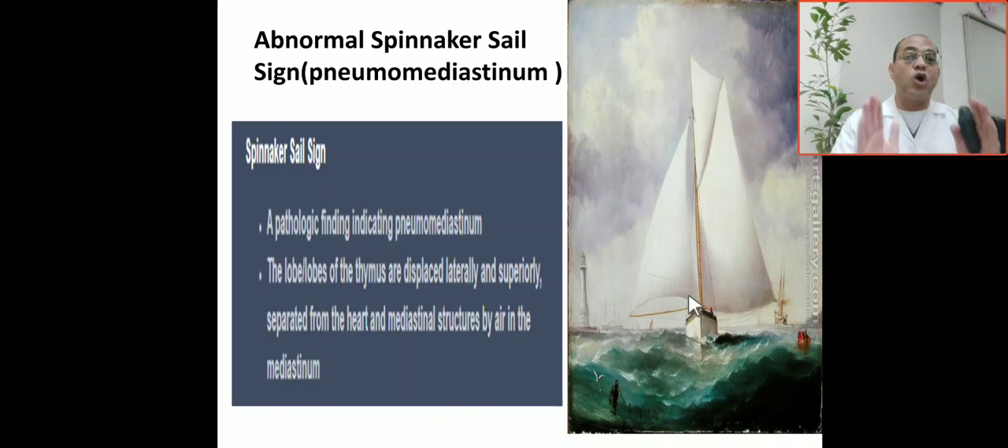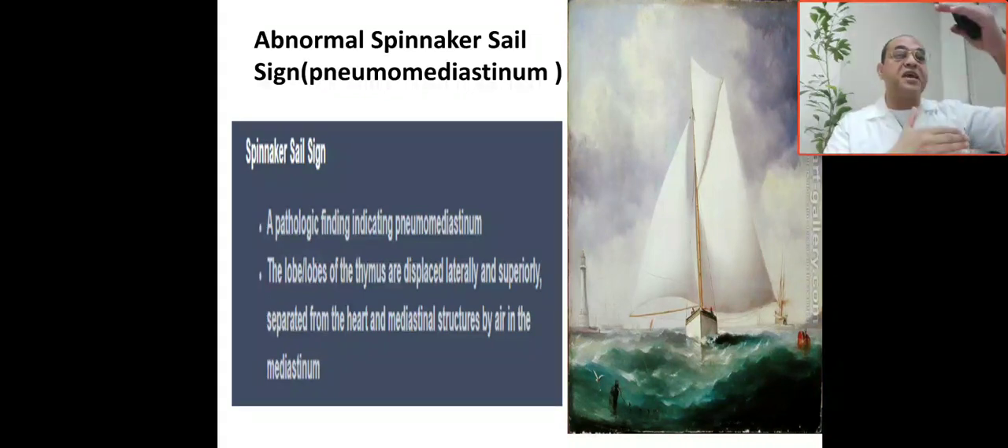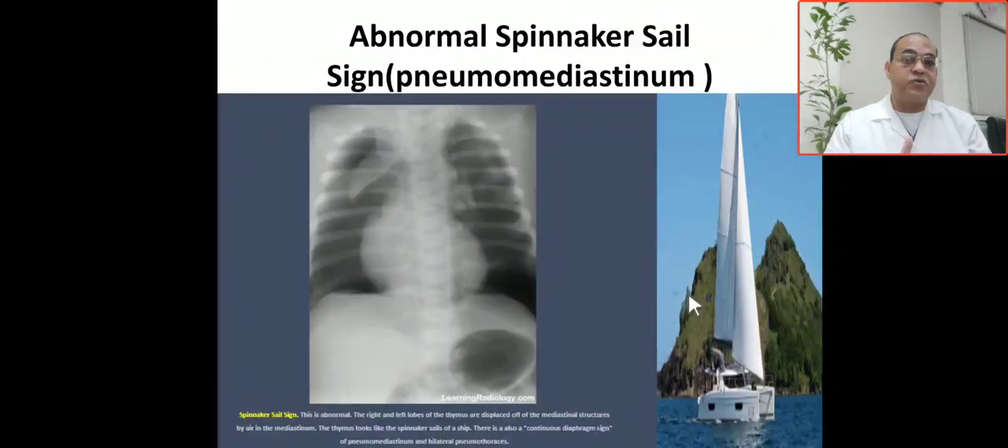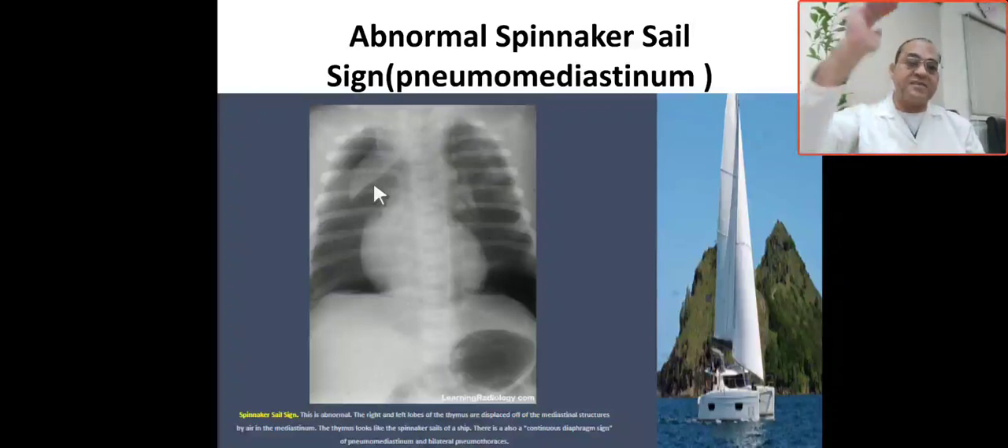This is the abnormal thymic sign, indicating pneumomediastinum. The thymic sign becomes pathologically abnormal when the thymus is separated from the heart and mediastinum by air, and is displaced upward and laterally. If you see separation between the heart and mediastinum by air, and the thymus is displaced up and laterally, this is considered pathological — an abnormal thymic sign indicating pneumomediastinum.